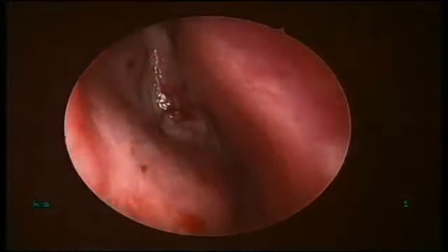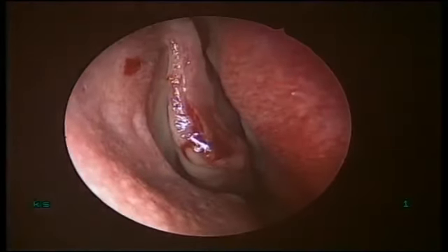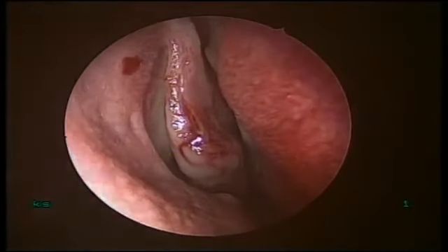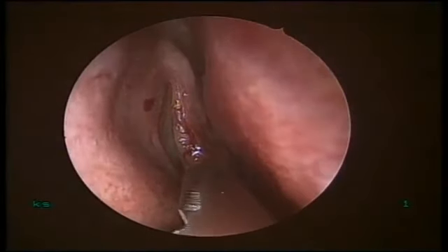So our goal is to open up this system and marsupialize, and our technique involves raising a flap. See, if it is done properly, this is one of the surgeries where you can give almost 100% results. So I am going to make a rhomboid shaped flap based posteriorly.